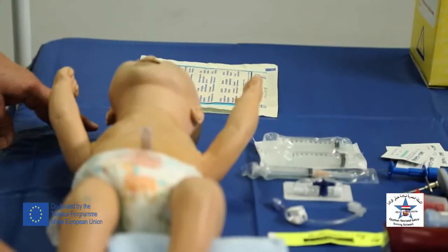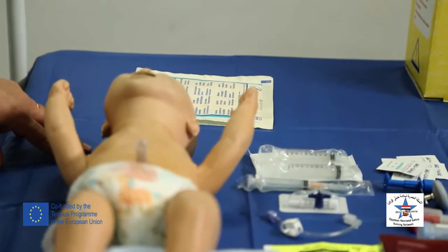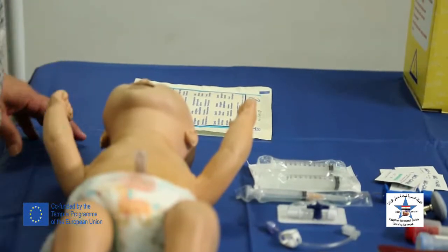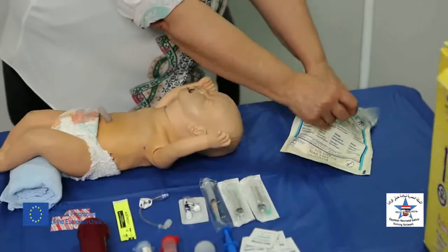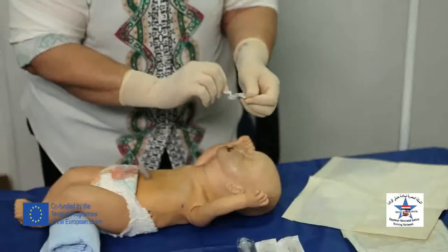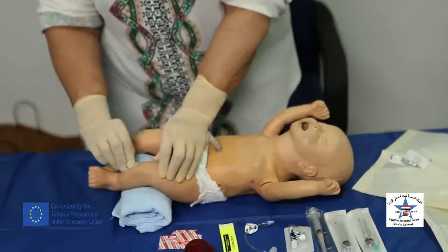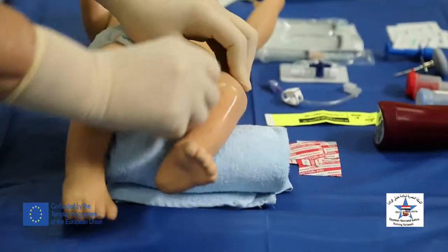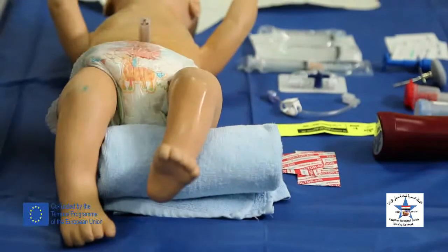The procedure is performed under an antiseptic technique, wearing sterile gloves after proper hand washing. Clean with an alcohol swab. Rub the area of insertion in a circular manner from inside out.